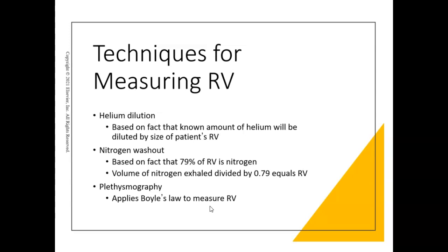And that is going to indicate those pressures in the alveoli. So again, there's a lot of physics behind this, a lot with Boyle's law, where you all hated gas laws the first time around. I think it makes more sense when we do it in the lab.